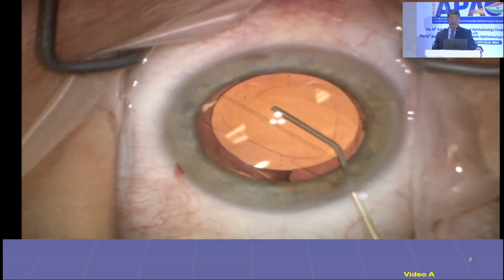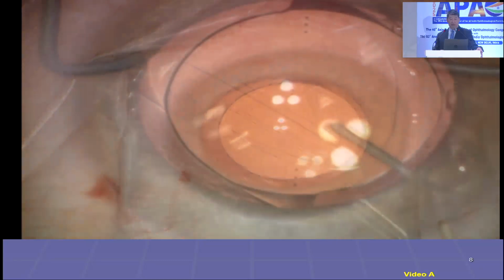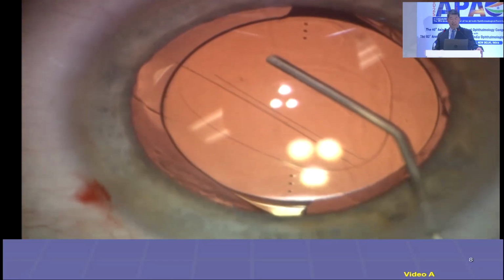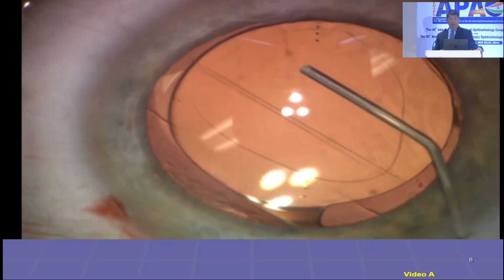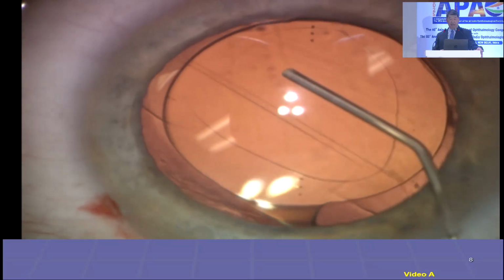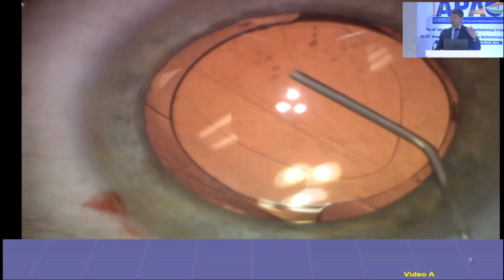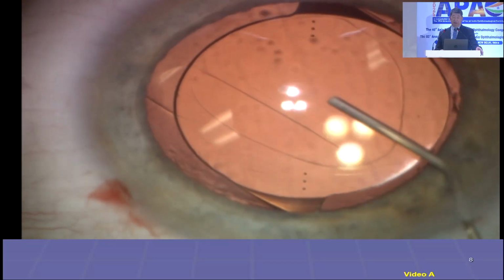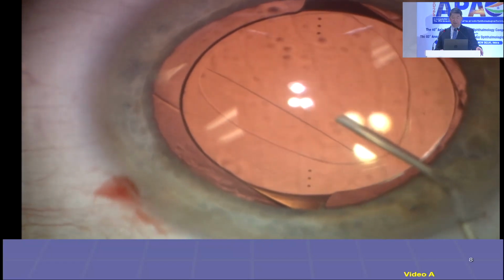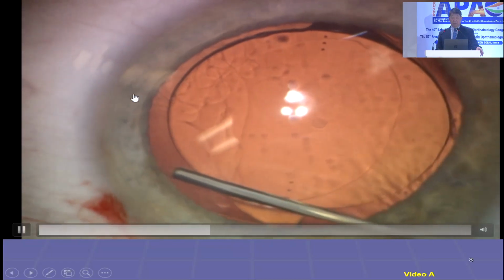She said, okay. So I go in and I see these folds there. I said, did I miss something? But so I'm just here with lidocaine, and I said, yeah, no, that's the posterior capsule, and the lens is pretty mobile. We know with the Acrysof, you have those terminal bulbs, and it might be fibrotic then. So I'm going to go for it.